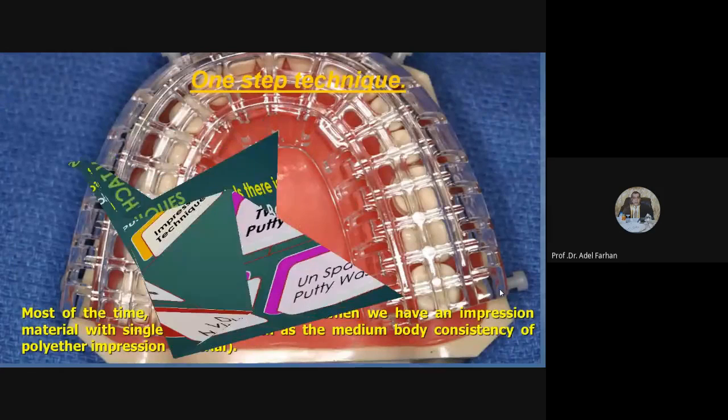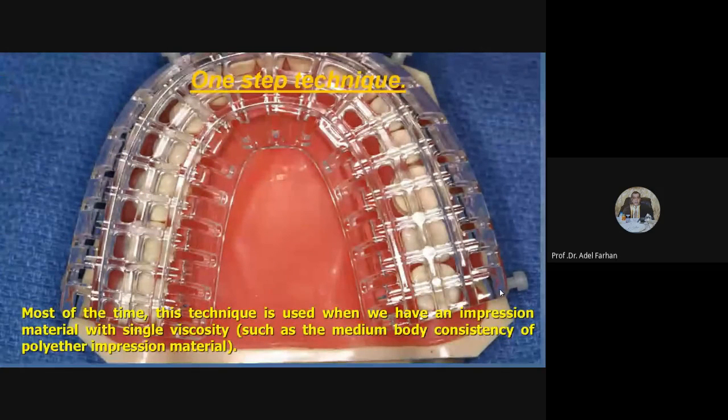شنو نقصد بالone step؟ One step most of the time, this technique we use when we have material of single viscosity. لما عندنا material single viscosity واغلب الاحيان هي الميديوم، لان اللايت ما نقدر نستعملها in monophase او a single mix. Most of the time نستعمل هاي التكنيك طبعا بالpartial denture، يستعملون الميديوم consistency material.